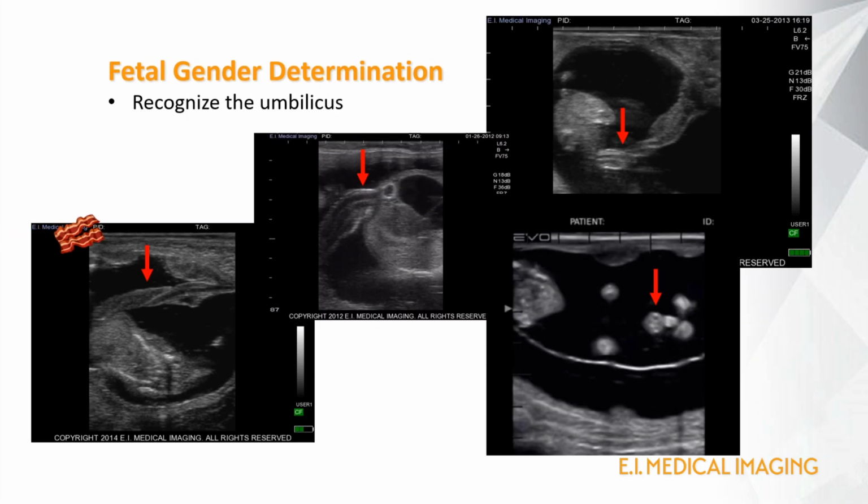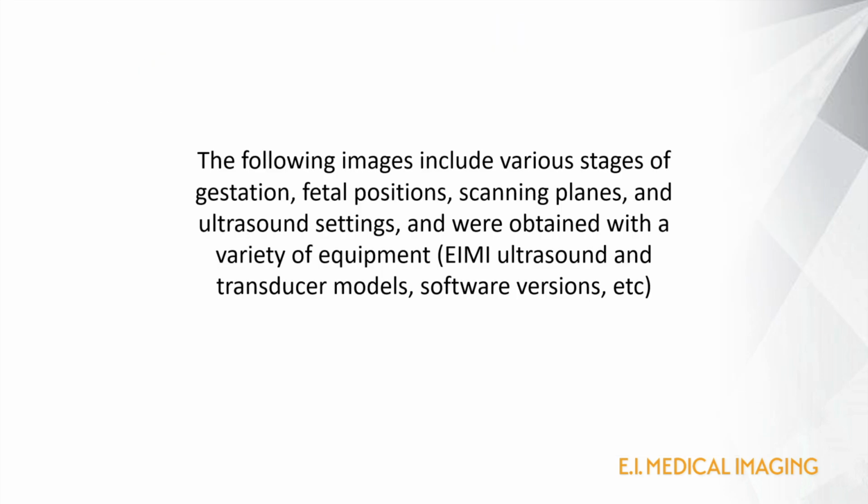Remember that the umbilicus has a strip of bacon-like appearance in longitudinal section and is reminiscent of a chocolate chip cookie in cross-section thanks to the large black vessels running through it. This structure is a major landmark for locating the male GT and obtaining a negative female identification.